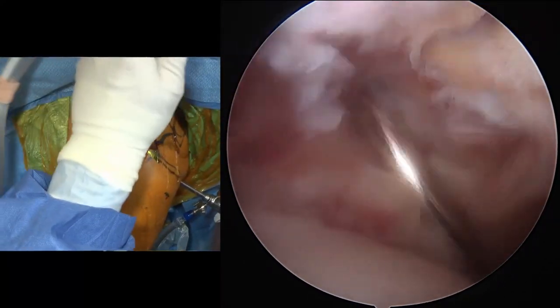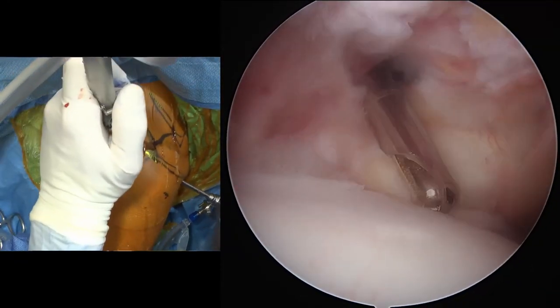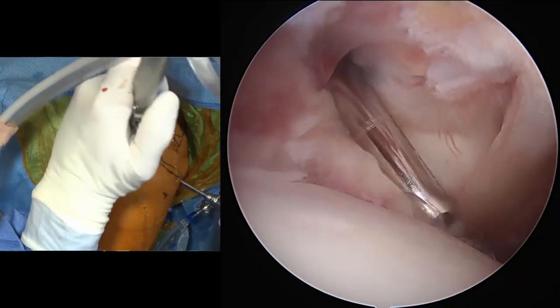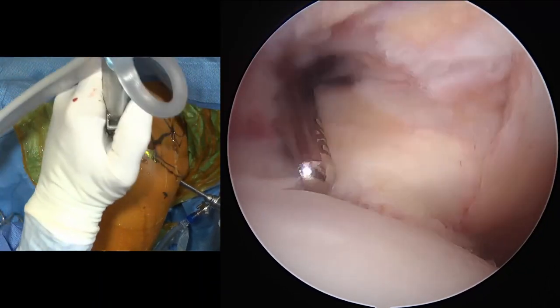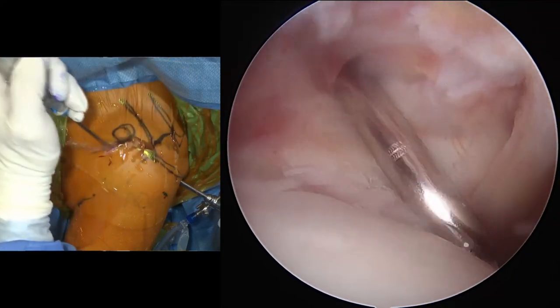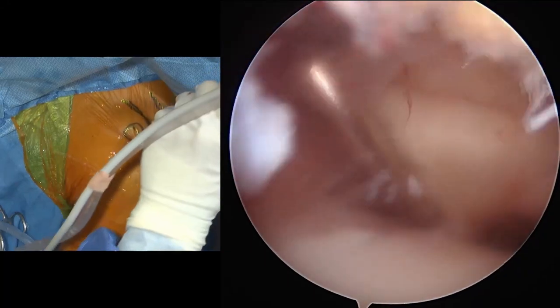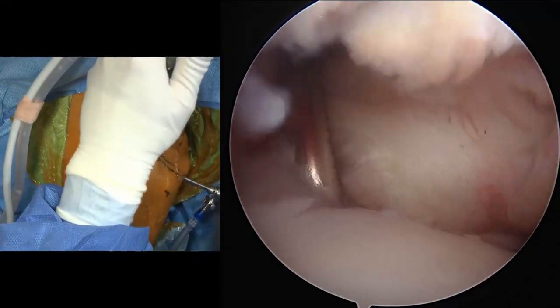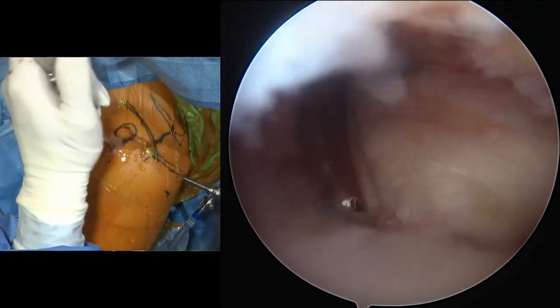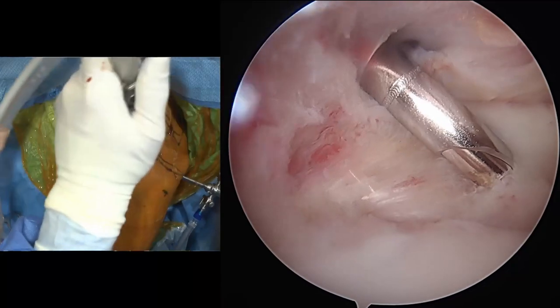I'm not sure I want to restrict his motion, which is what would happen here. So he's got a partial thickness tear, but most of the integrity looks intact. With the biceps out of the way, this should be okay. So if I just trim that back a little bit, that looks pretty good now. It's an undersurface tear of his subscap, and that tissue looks pretty good. So I think we'll probably leave that alone.